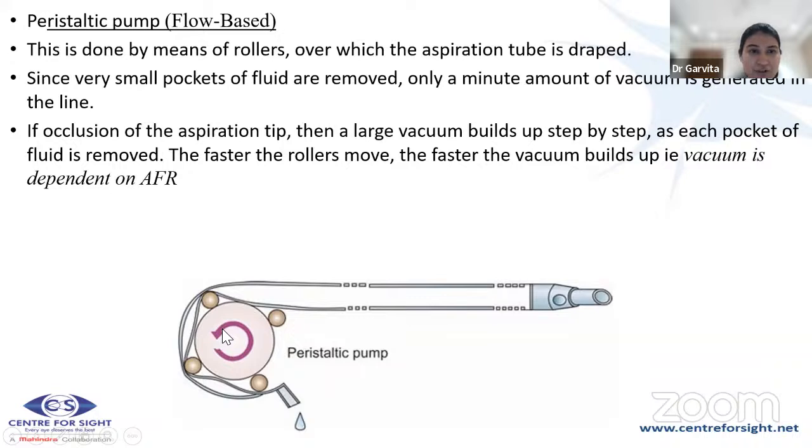Therefore, we can say the vacuum depends on the aspiration flow rate, which is the amount of fluid exiting the eye, going into the aspiration.